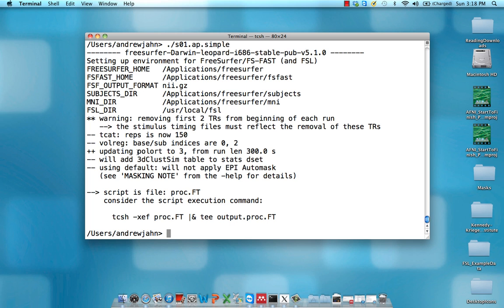This whole Polort thing, you don't need to worry about it too much. But what it does is it increases the longer your runs get. So if it was 400 seconds, it would be Polort to four. It's just what order polynomial it does to try to get rid of any sort of drift artifacts or anything that is unrelated to actual functional activation.